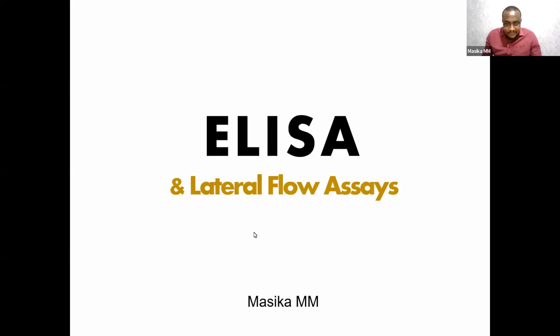For virology, ELISA for virology, and lateral flow assays. Lateral flow assays are probably better known as rapid detection tests or RDTs. These are the things we use for testing things like HIV, even pregnancy, on the bench or on the table or at the clinic.